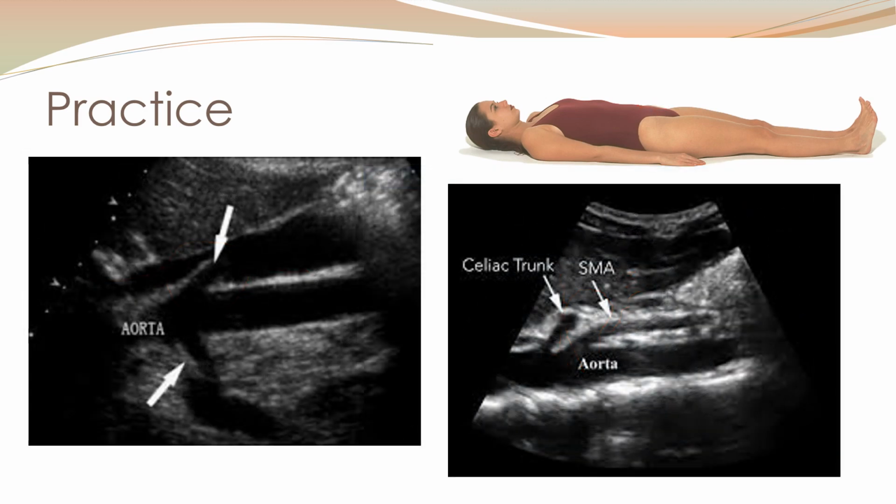Now this is an interesting one. In this image, this is our typical aorta, what we see if we're in the regular mid-sagittal plane in long axis. We see our aorta coming down. We see there's a celiac axis, there's an SMA, there's a little renal vein crossing under the SMA there, and then our aorta proceeds down.